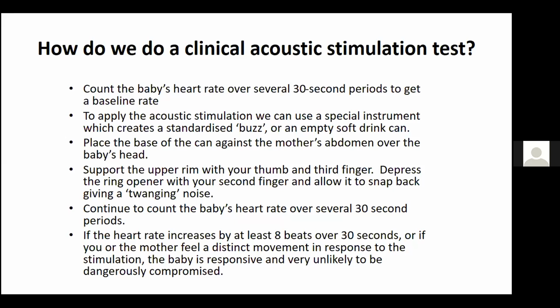Then if the heart rate increases by at least 8 beats over 30 seconds, or if the mother really feels distinct movement in response to the stimulation, this is actually promising that the tracing will start to improve and will start showing good variability.